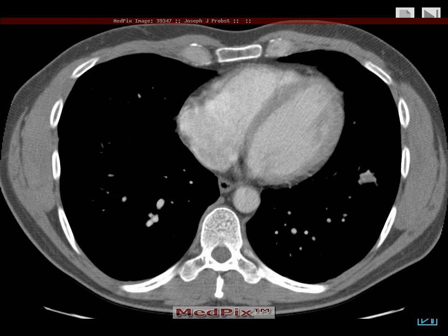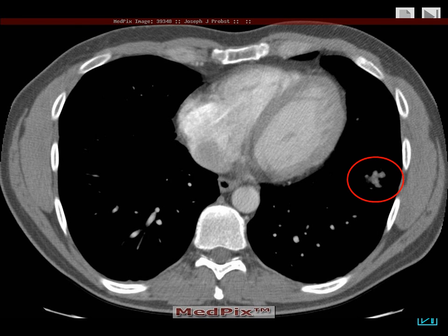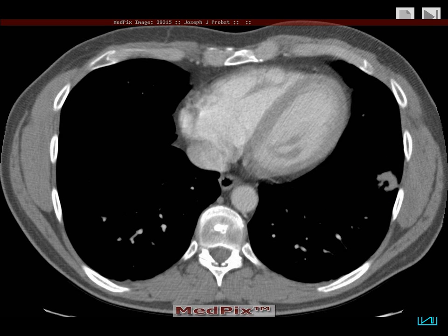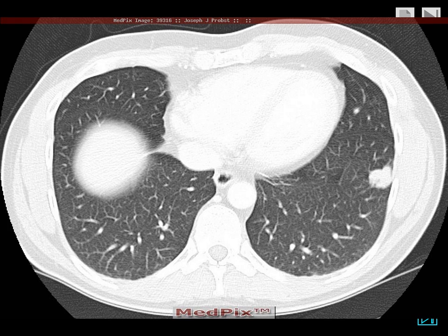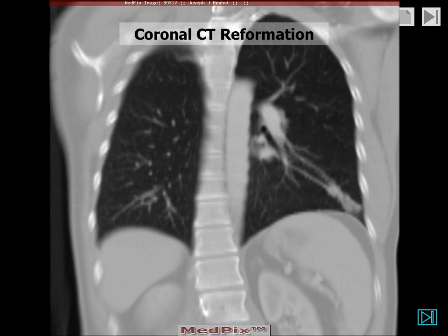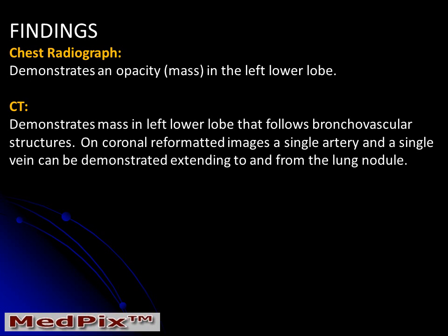The chest CT clearly demonstrates a pulmonary nodule extending to the periphery of the left lung. We can also see this with lung windows. A coronal reformation demonstrates linear opacities that appear to connect the pulmonary nodule with the left hilum.